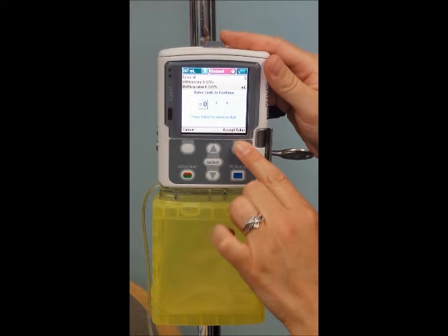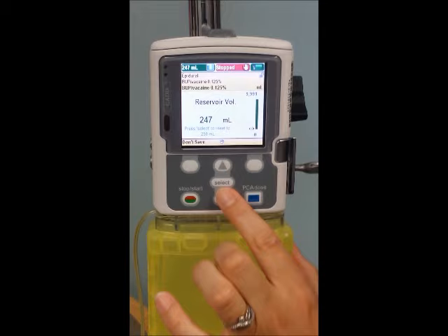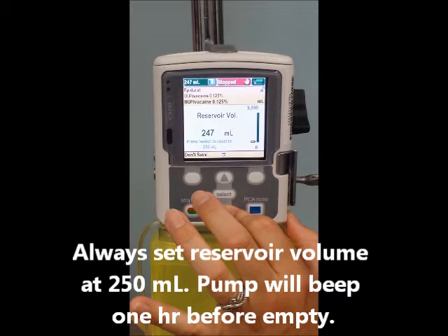Your code, as we discussed, is 999. After you've inserted your code, it will bring you to this screen asking you what the reservoir volume is. Each of these will come from pharmacy with 250 mils, so select your amount and hit save.